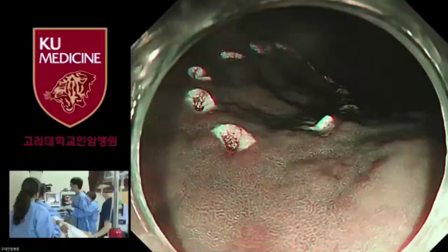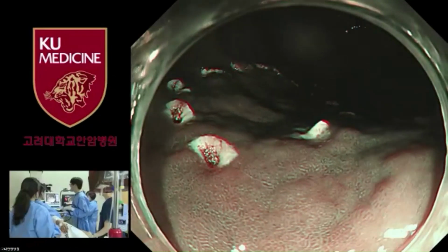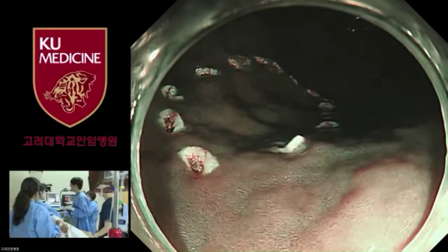Yeah, we also use only NBI. Sometimes, in cases of serious atrophy or metaplasia, chromoendoscopy using indigo carmine is very helpful. So I usually use both. Okay, now marking. Yes, we inject. I agree with the opinion.